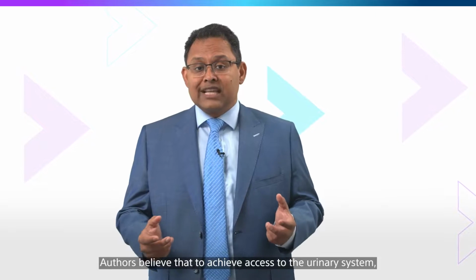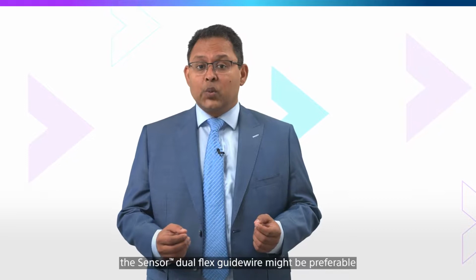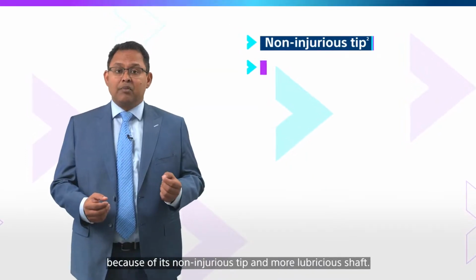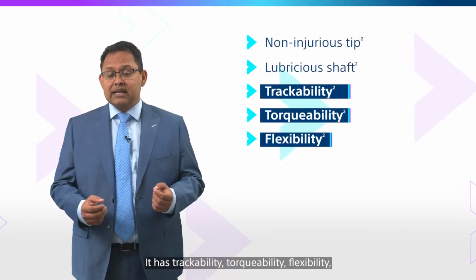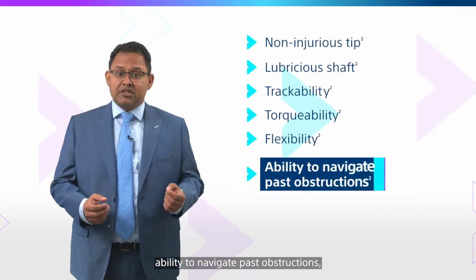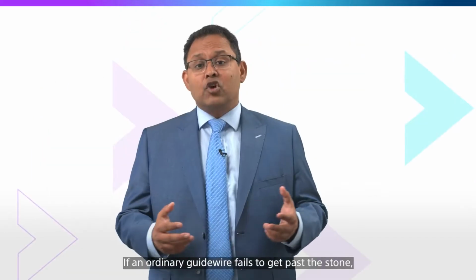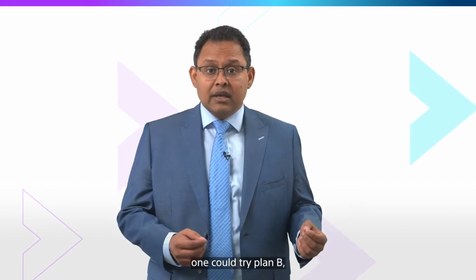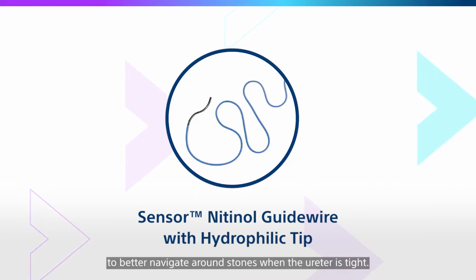Authors believe that to achieve access to the urinary system, the Sensor dual flex guide wire might be preferable because of its non-injurious tip and more lubricious shaft. It has trackability, torqueability, flexibility, the ability to navigate past obstructions, and the ability to support another device over it. If an ordinary guide wire fails to get past the stone, one could try plan B, which would be a sensor wire, which has a hydrophilic tip that allows it to better navigate around stones when the ureter is tight.